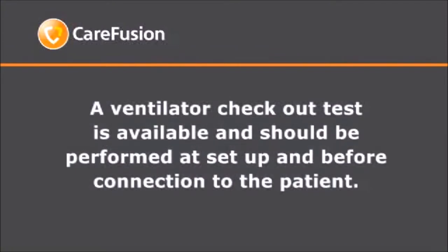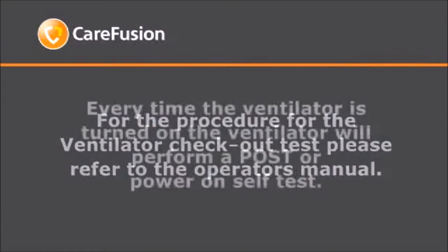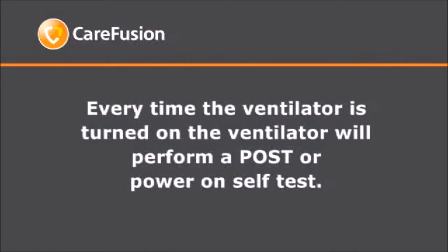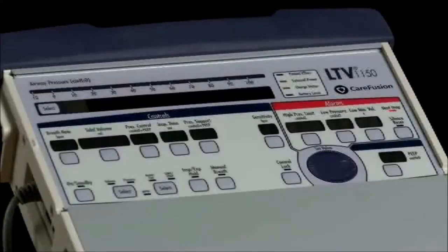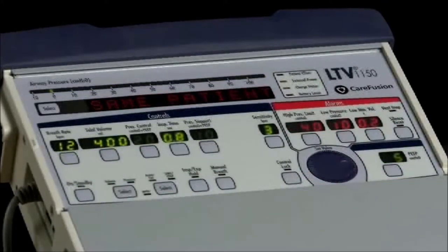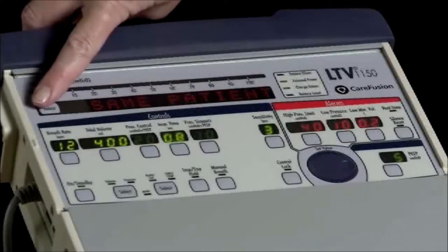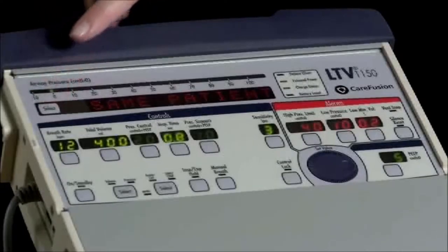A ventilator checkout test is available and should be performed at setup and before connection to the patient. For the procedure, please refer to the operator's manual. Every time the ventilator is turned on, the ventilator will perform a POST, or power-on self-test. The POST is a set of self-tests the ventilator performs when turned on to verify the operational integrity of the ventilator. To start the LTV 1150, push the on/standby button once. The ventilator will perform a POST. If the patient query feature is on, the ventilator will display "same patient." If the LTV 1150 will be placed on the same patient, press the select button next to the display window, and ventilation will begin with the settings in use during the last power cycle.